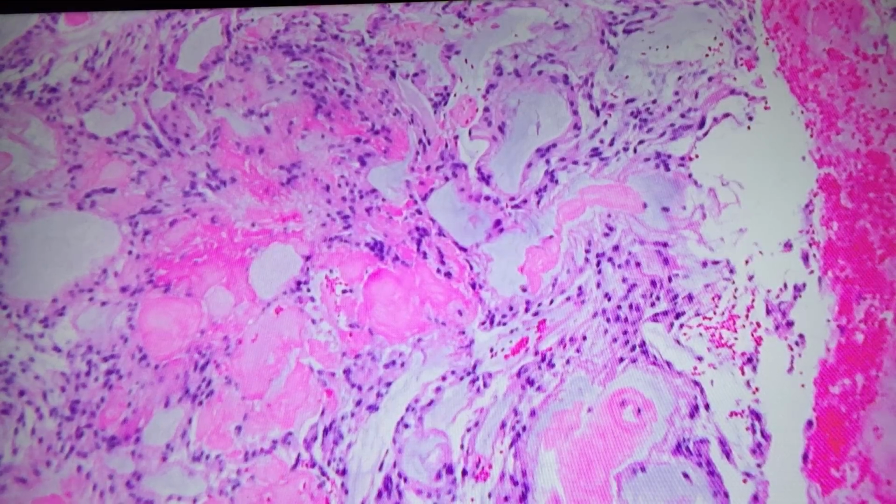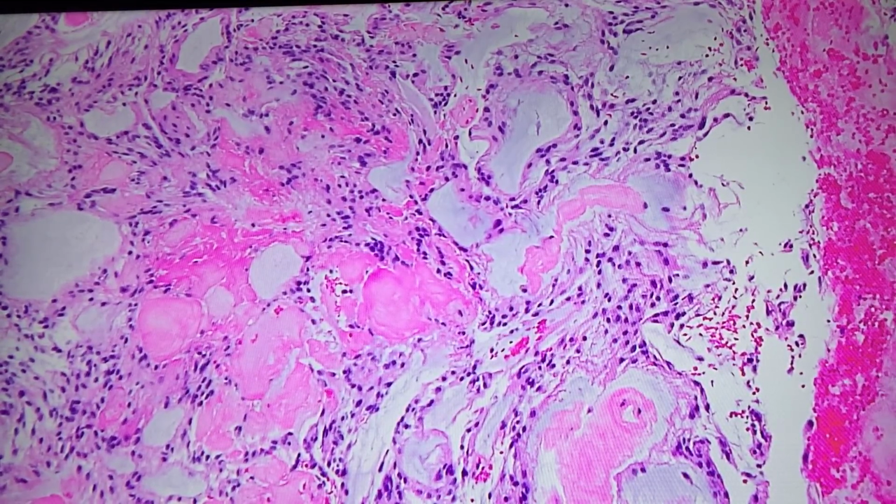All right, very good, guys. Where do these things occur? Any take-home message about it? These are benign. They occur in the spine. You'll see them on frozen section. Sometimes they recur if they're incompletely resected. Perfect. All right. Next case.